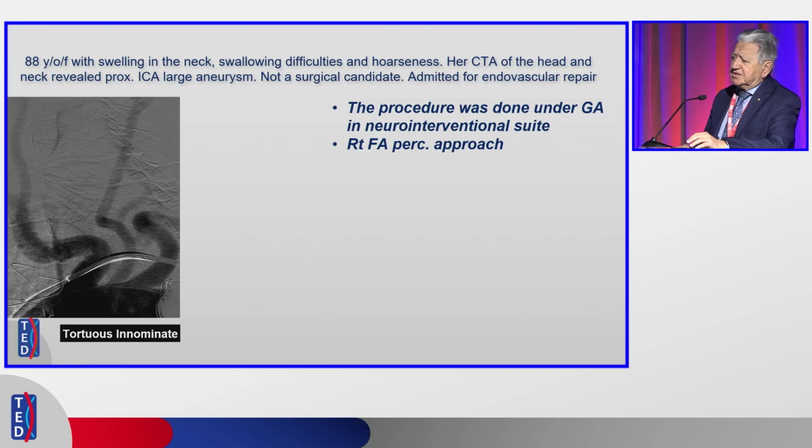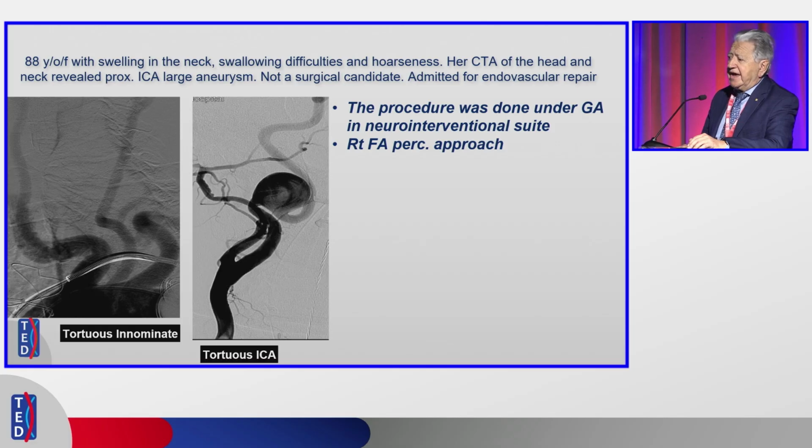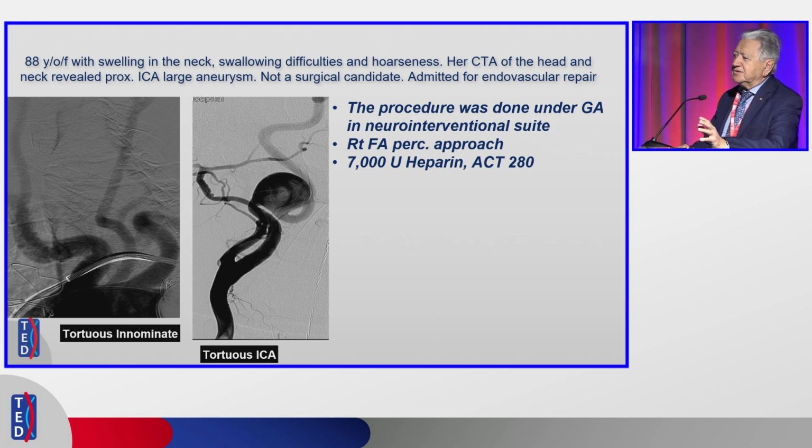But as you can see, this is extremely challenging anatomy, a lot of tortuosity there. And here is the aneurysm, as you can see it. Again, a lot of tortuosity. So we worked on similar cases, maybe 10 or 15 cases like this, with a variety of different approaches, but this one we were doing in a live demonstration case during one of our symposia, and we thought that we could do it. So we heparinized the patient.